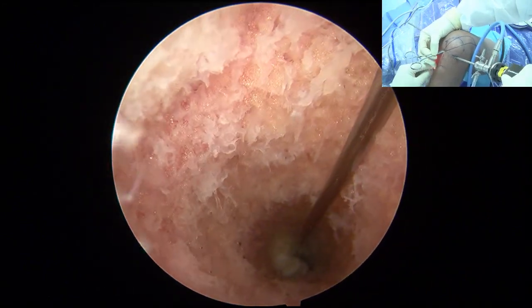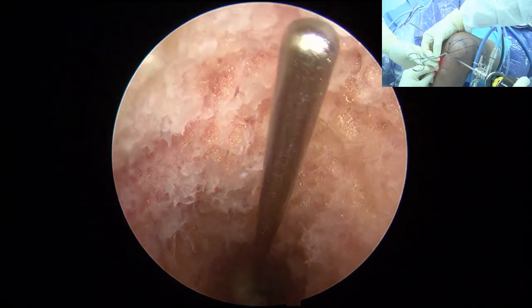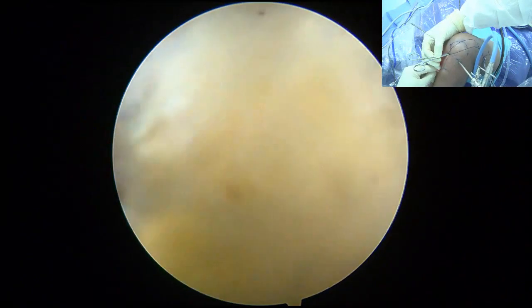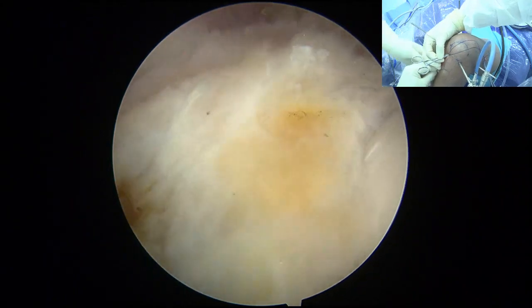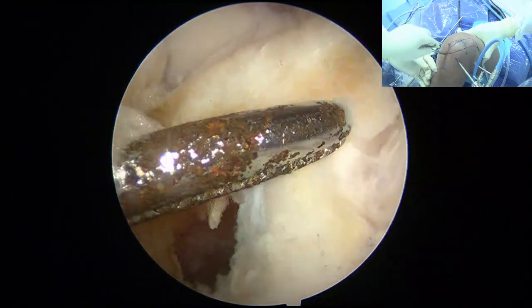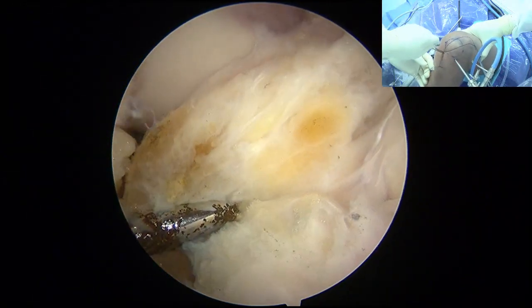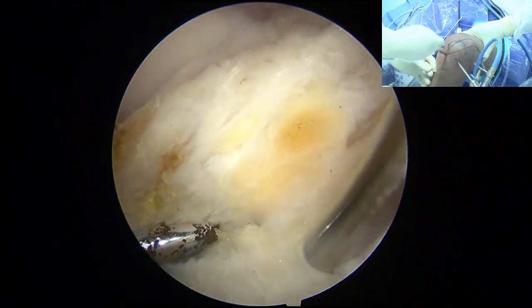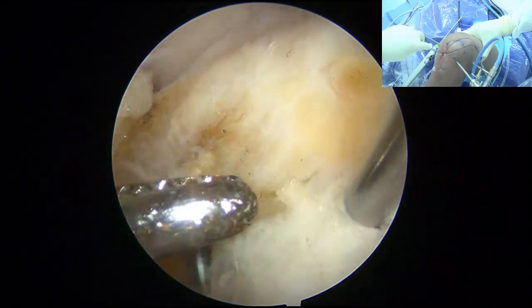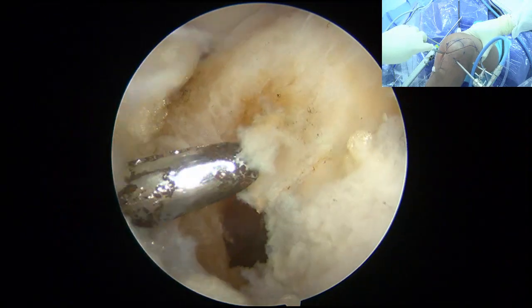So the technique is I will put this here, okay, in the posterolateral area. 好，我现在导针呢是在进入骨隧道了，而且呢是占据后外侧。And then we put this guide into the posterolateral 隧道的后外侧。 Okay, good. So that guide will stay in the posterolateral. I put it in the soft tissue to block it.